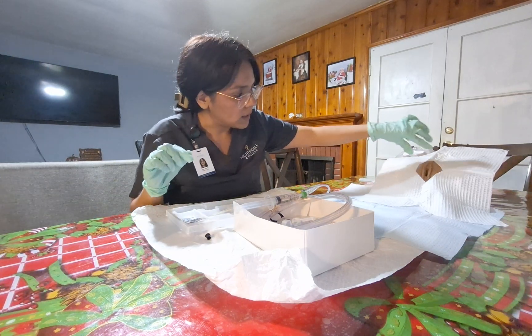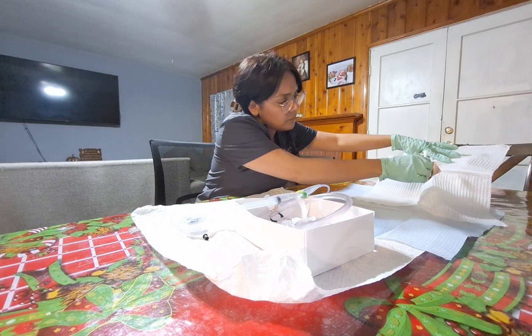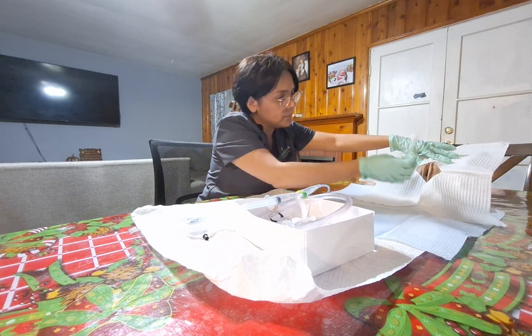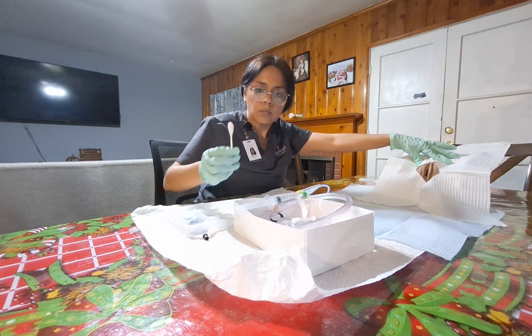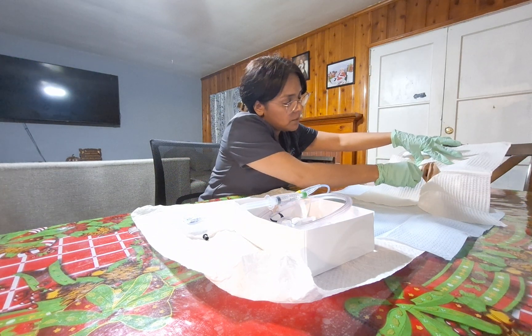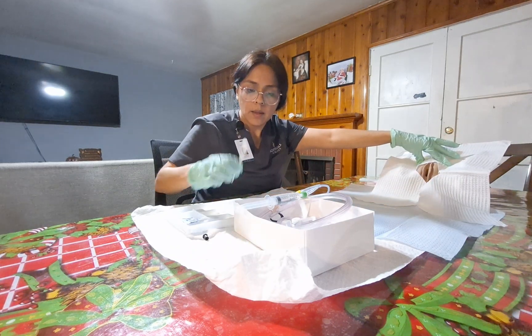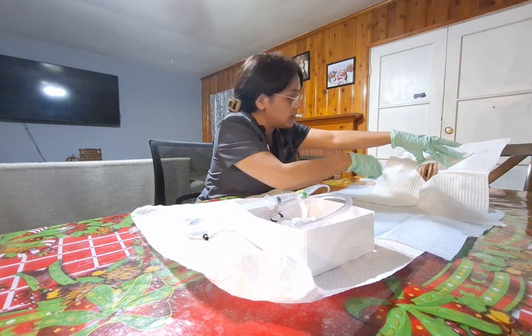Mrs. Garcia, we're going to go ahead and clean the area. I'm going to take the swab and swab the farthest area from top to bottom and throw this away, then top to bottom on the closest side and throw it away, then top to bottom down the meatus area.